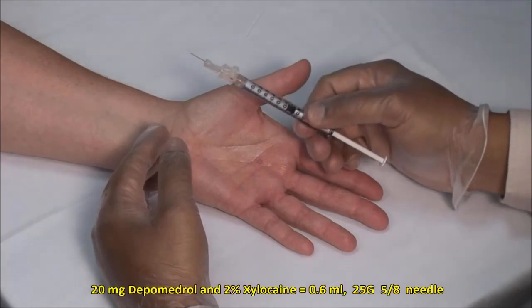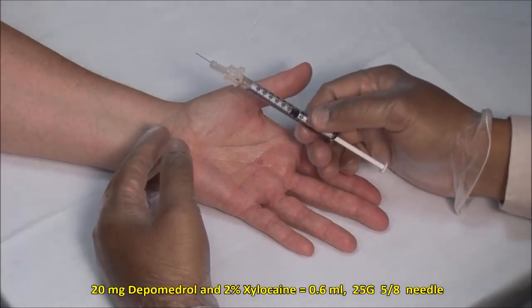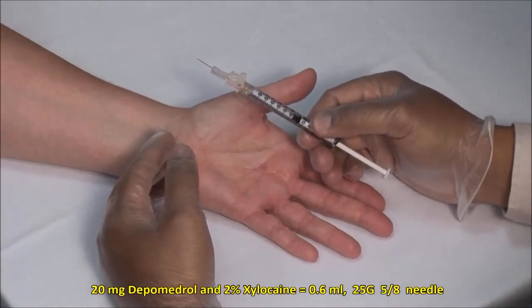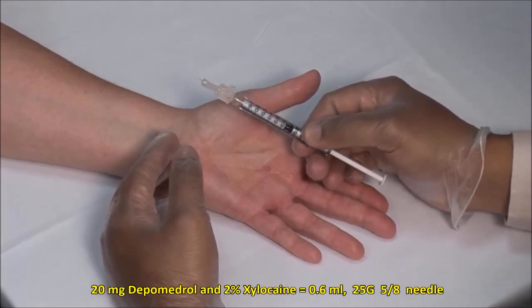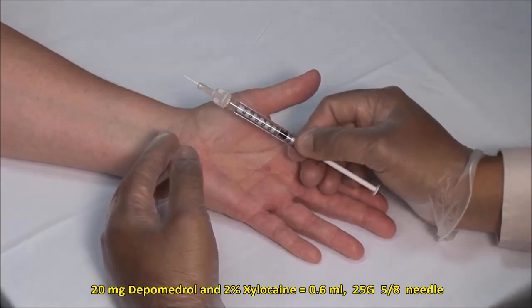Here I have a 1ml syringe with a 25 gauge 5/8 inch needle and a mixture of 20 milligrams of depo-medrol and 2% xylocaine made up to a volume of 0.6ml.